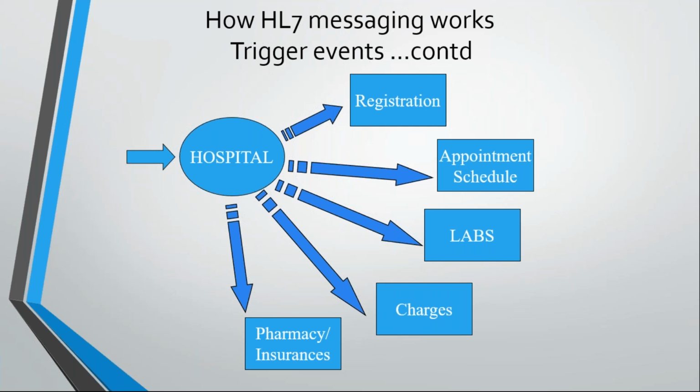Yeah, you can definitely prioritize. So what we are going to cover is the basic and generic stuff, which has to be known for all HL7 interface analysts. From an interface perspective and from an HL7 perspective, you should at least know what are the events that are part of registration, appointments, charges and labs. And there are advanced message types as well, like the MDM message type.